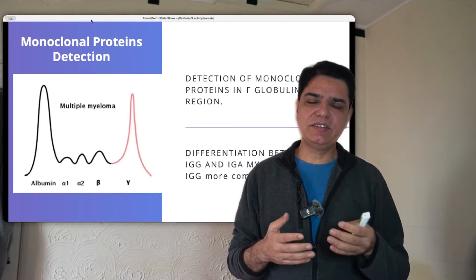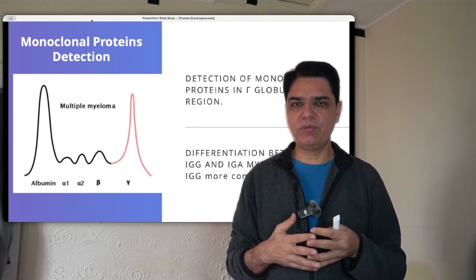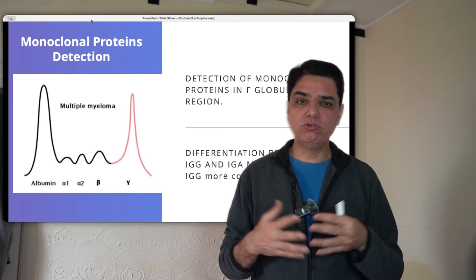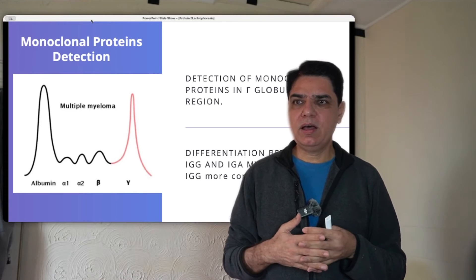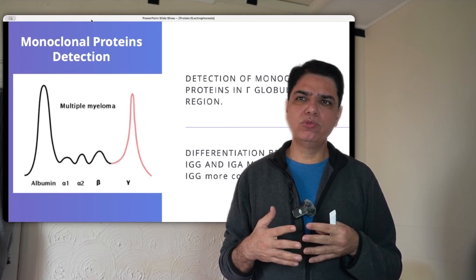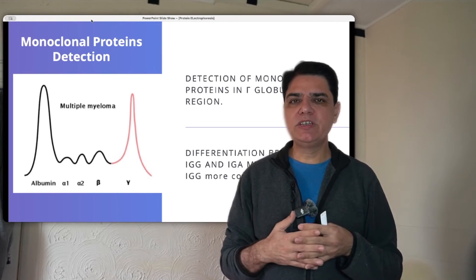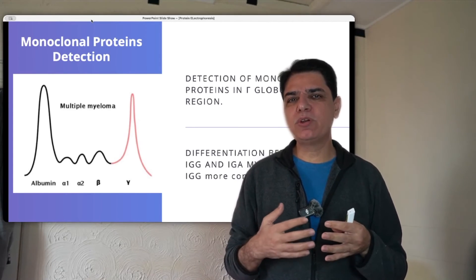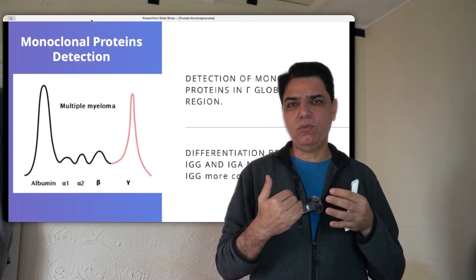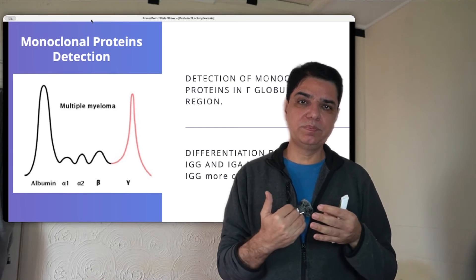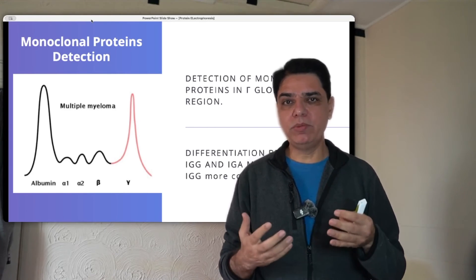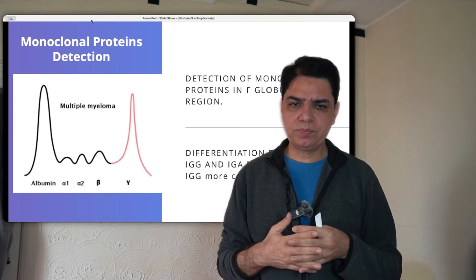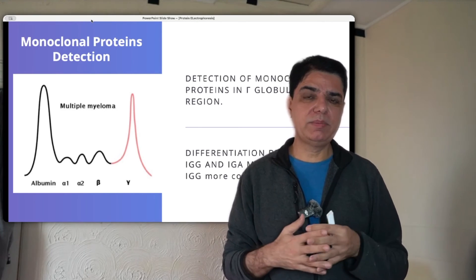Last but not least, if you see a spike at the very end — in the gamma protein region — that is what we call multiple myeloma. These abnormal proteins can also be detected in urine as Bence Jones protein. The most common type is IgG gammopathy, followed by IgA, though immunofixation testing is needed to determine the specific immunoglobulin subtype that is elevated.